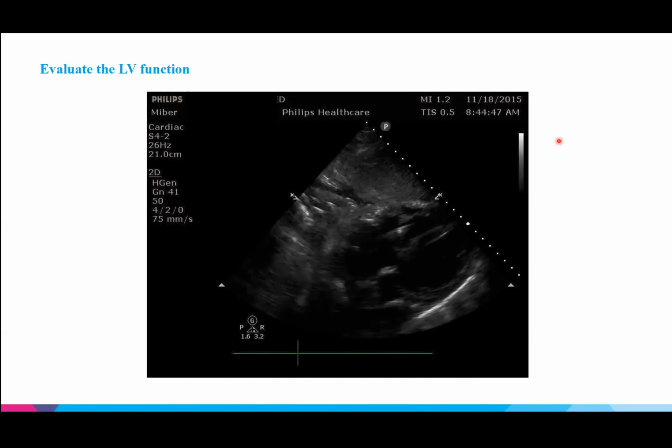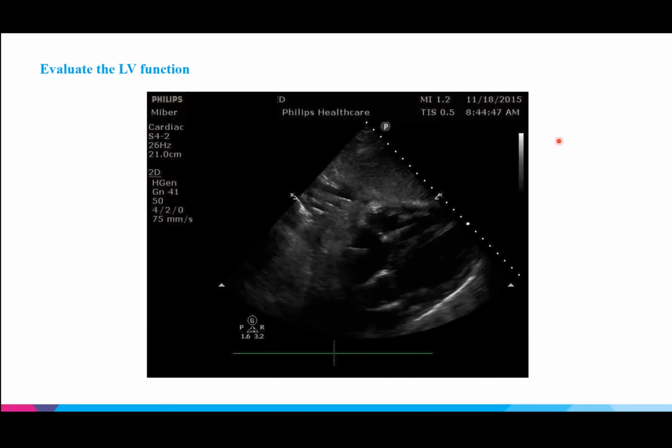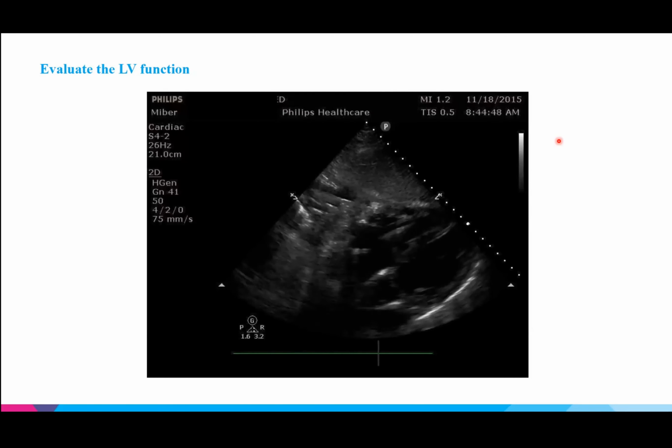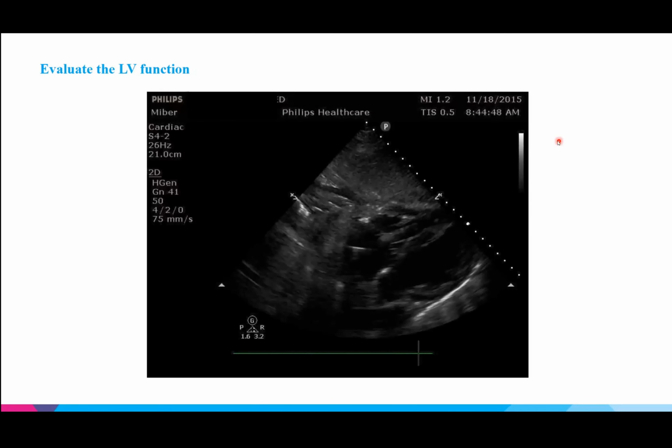We just need a few more. Maybe 50% have done it so far, so feel free to guess, guys. All right, good. So we have a differential between reduced and severely reduced.